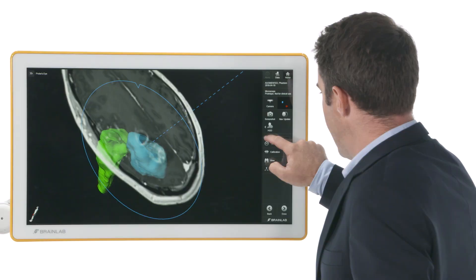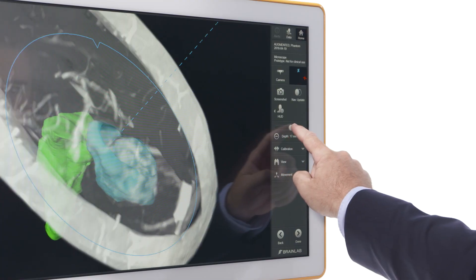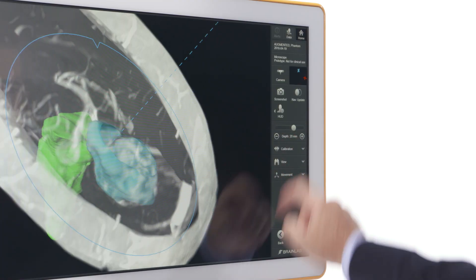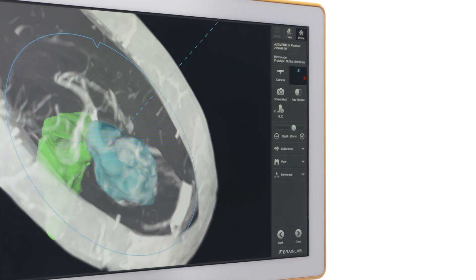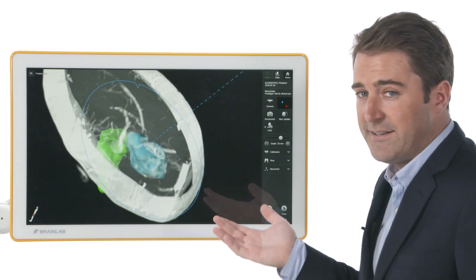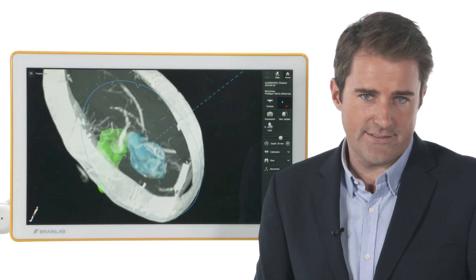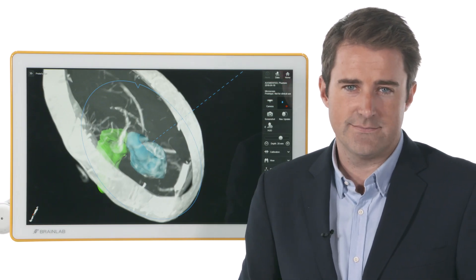By adding slices, the reconstruction transforms into a maximum intensity projection, or MIP, and increases the level of vascular detail.